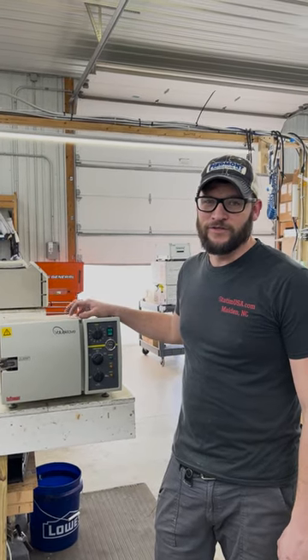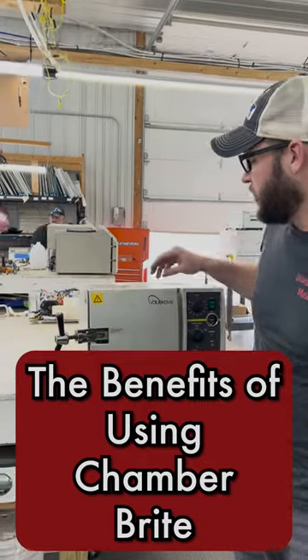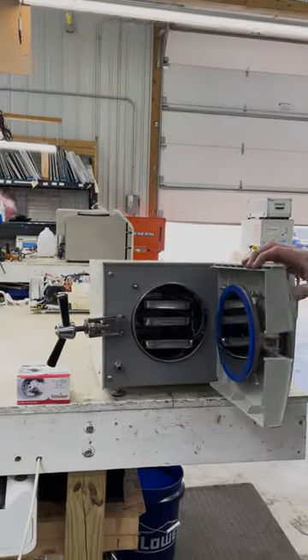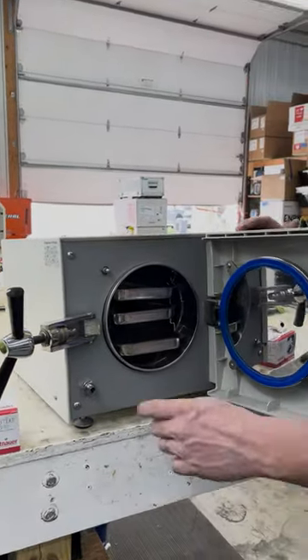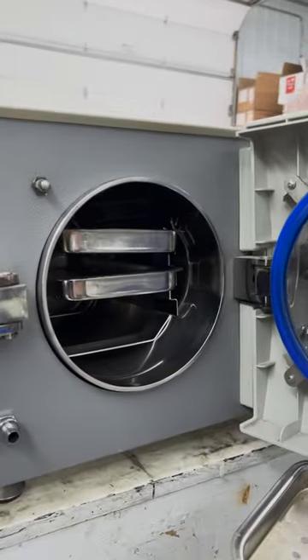Hi, this is Ian with Sterilizer Autoclave Solutions. Today we are looking at the benefits of Chamberbrite. Chamberbrite is a cleaning product. On this 1730, I would use half a pack of Chamberbrite and put it in the bottom of the chamber.